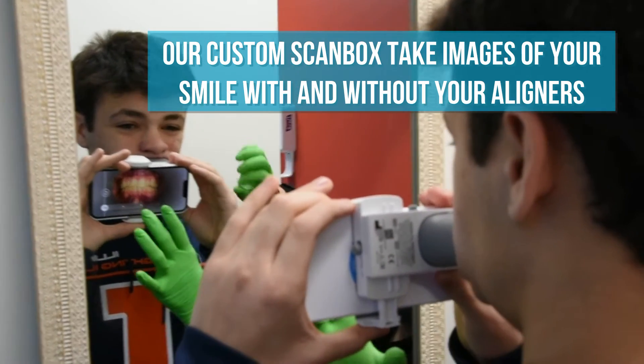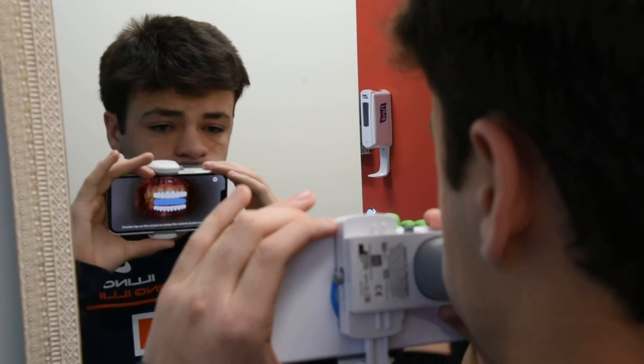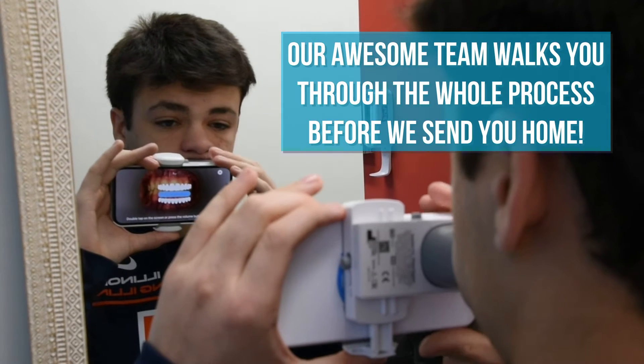Come back to me, but you're okay. Alright. For this next step, when you do it, shift your hands — not your head — where it goes side to side. Double tap to continue. Open a little bit.